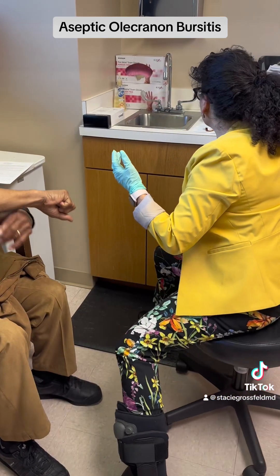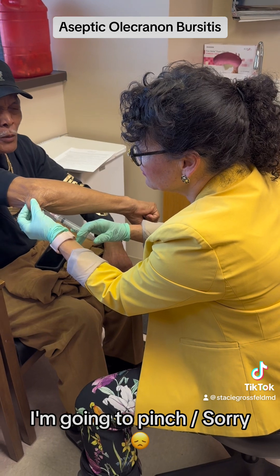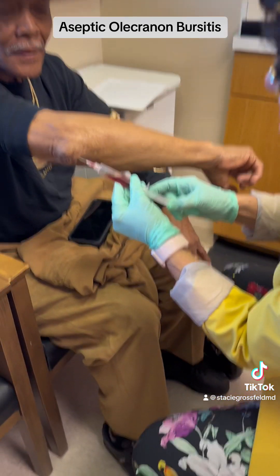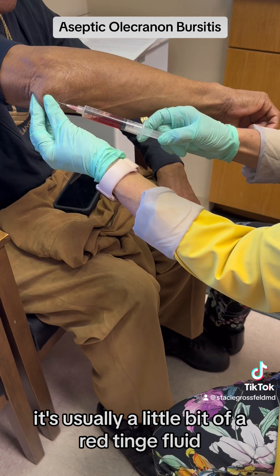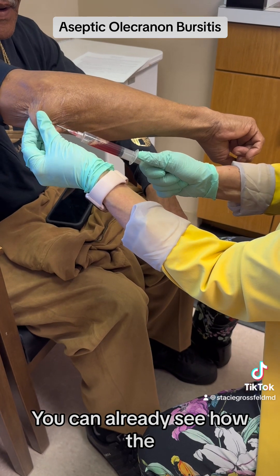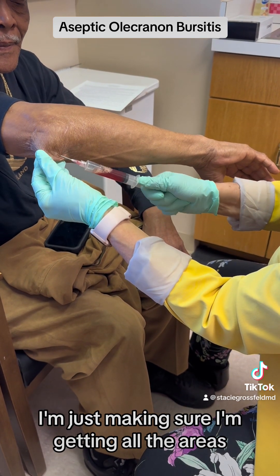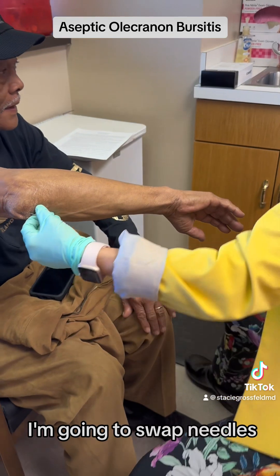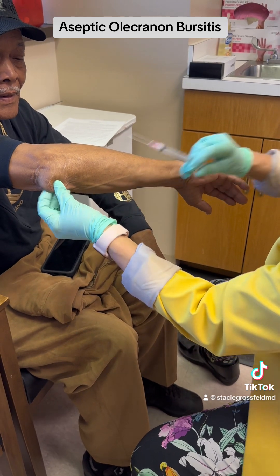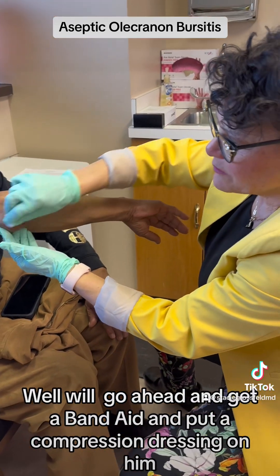We've already prepped this area. I'm going to go ahead — pinch and burn — and then you're going to see this fluid come out. Usually the olecranon bursa fluid has a little bit of a red tinge. No sign of any purulent material. You can already see how the bursa is decompressing here. Sometimes it can be loculated, so I'm just making sure I'm getting all the areas. Then I'm going to swap needles and go ahead and put in the steroid right here.